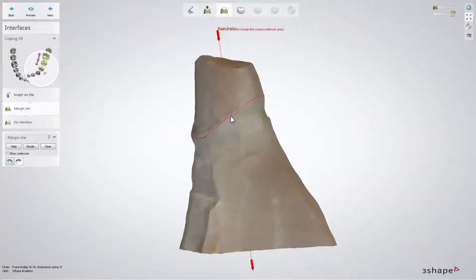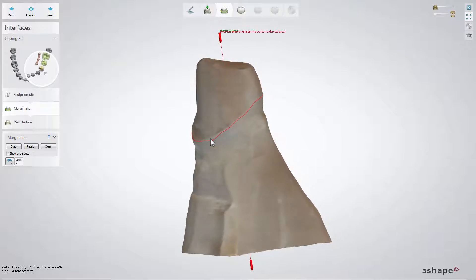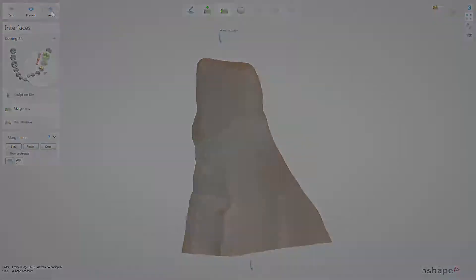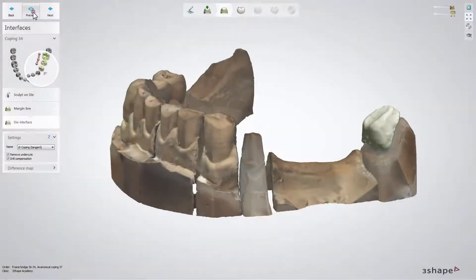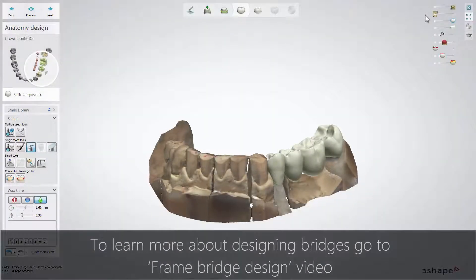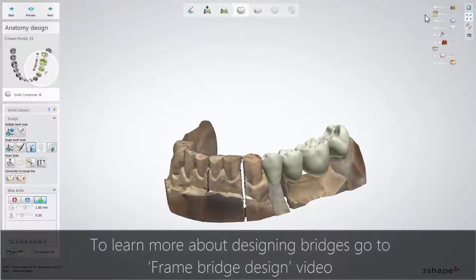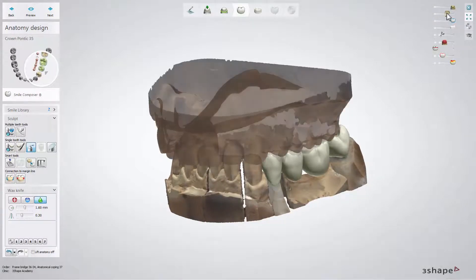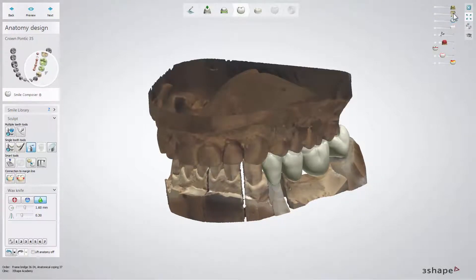At this point, please specify as usual the margin line, the die interface and the anatomy design, and then proceed to the frame design step. These steps are the same as if the bridge was not the split construction.